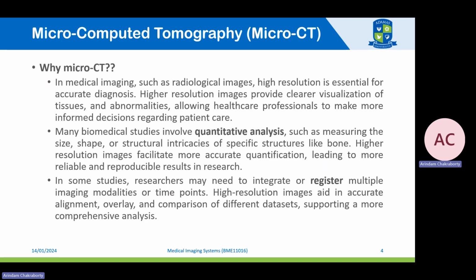So it can be well understood that the images thus formed from micro CT can provide clearer visualization of tissues and its abnormalities, thereby allowing clinicians or healthcare researchers to make more informed decisions regarding patient care or understanding the interaction between different objects at a very minute scale.